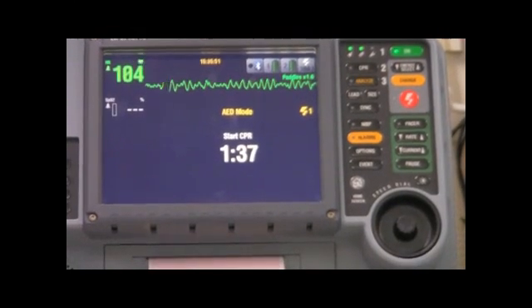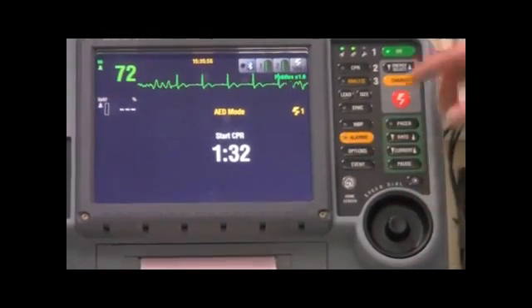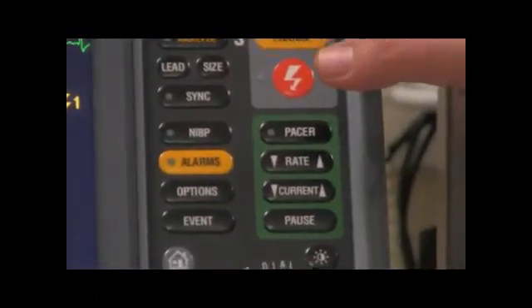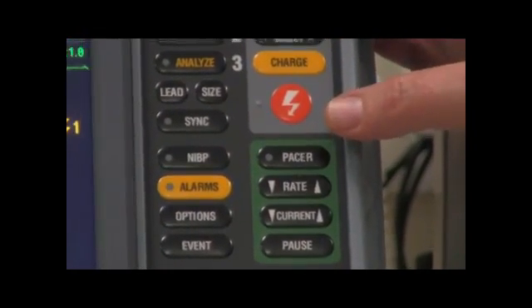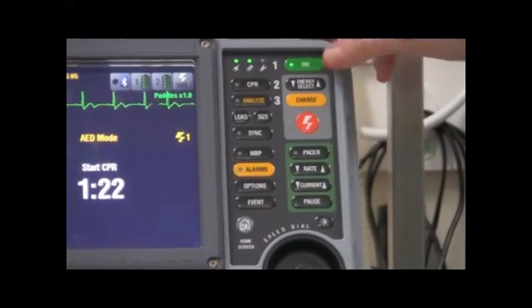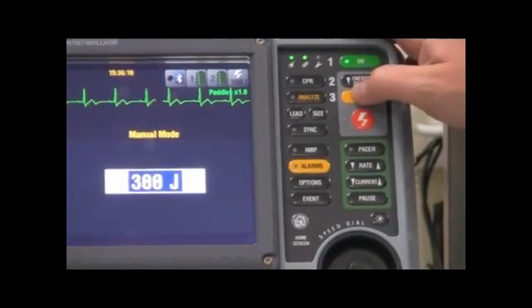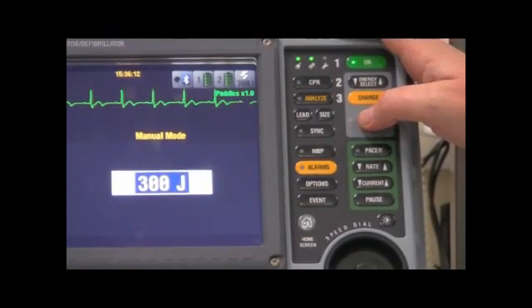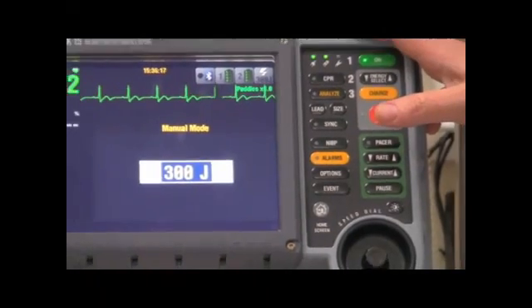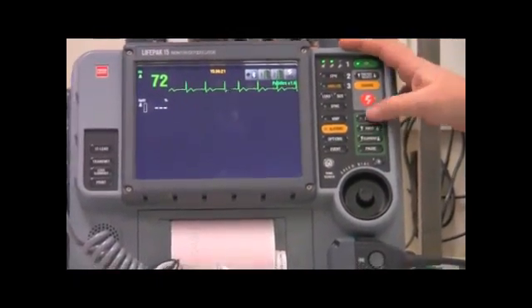I'll put it back inside so it's not going to alarm us. And the other option is if you felt confident and competent and you recognised that there was a shockable rhythm and you wanted to shock someone, then you proceed down this side of the LifePak, which tells you how much energy you would like to select. You have to manually charge the machine, and then you have to manually deliver the shock. So that's basically how you would defibrillate someone. The next step that we can talk about is how to pace someone.